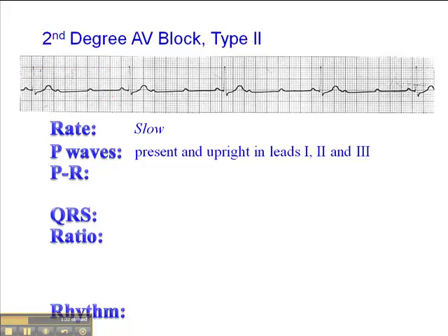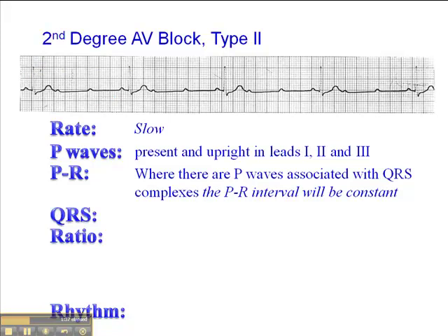Or even hemodynamically unstable, in which case they would need electrical therapy such as transcutaneous pacing. The P waves are present and upright in leads 1, 2, and 3. The PR interval, where there are P waves associated with a QRS complex, is constant. This PR interval here, associated with a QRS, is consistent with this one, this one, and that one. We don't see that in other heart blocks such as second-degree AV block type 1 or third-degree AV block, though you would see it in a first-degree AV block.